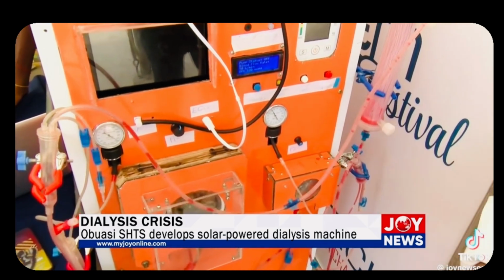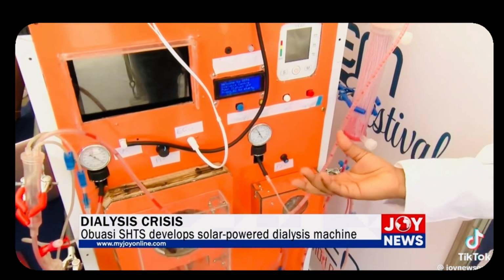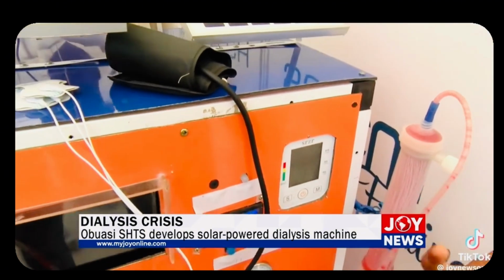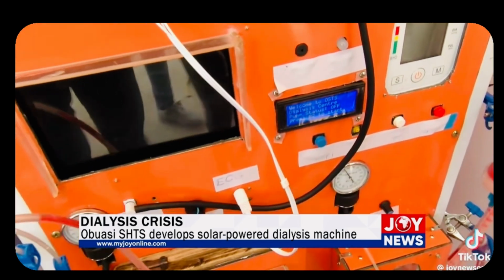For instance, when there is a significant drop in temperature, the machine may increase the pump speed to maintain the system to circulate. All the circulation should be constant and with no deviation. So we also have visual alarms that will alert the doctor to any deviations that I talked about, so that they can attend to the patients.